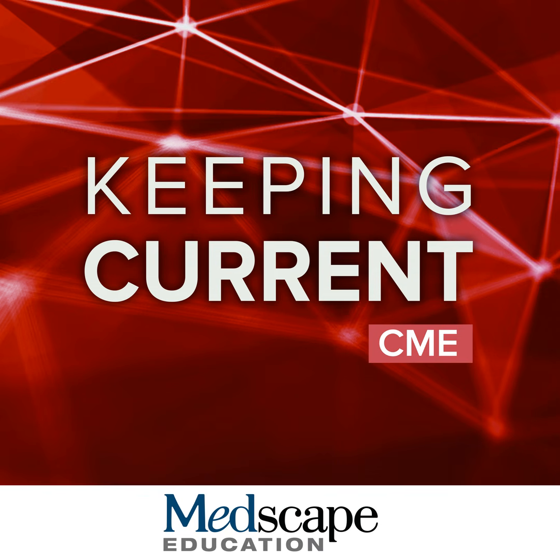So, practical notes. Right now in the US, plasma, CSF, and PET scans can be used to initiate therapy. It depends upon a patient's insurance which one of these is preferred, but amyloid PET was considered the gold standard in the clinical trials. And currently in 2026, probably very well covered in most areas. Now, which of these can be used to assess treatment response? Right now, only amyloid PET gives us that change result.